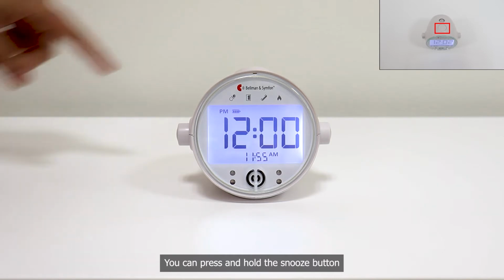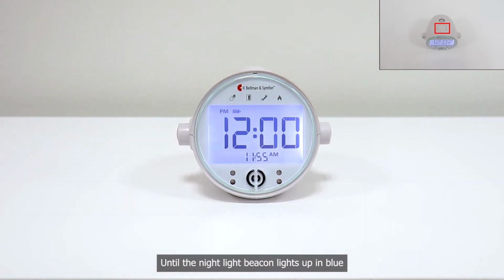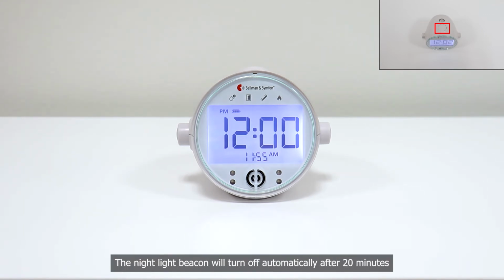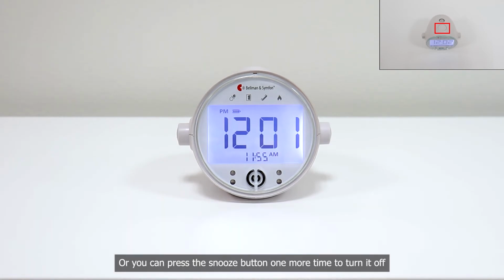Here are some additional features. You can press and hold the snooze button until the night light beacon lights up in blue. Now, if you have to get up at night, there is a gentle light guiding you back to bed. The night light beacon will turn off automatically after 20 minutes, or you can press the snooze button one more time to turn it off.